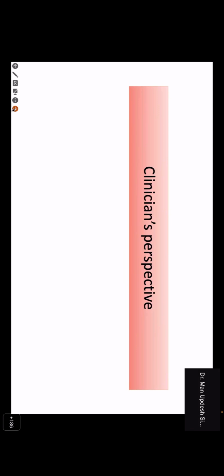in this scenario, I would rather do special stains, even if I don't see too much reaction and changes. A subtle reaction is good enough to do an AFB stain, a PAS stain, and you might be surprised to catch one odd organism without much reaction in immunosuppressed patients. So remember, when the patient has fever and immunosuppression, even without morphological clues which may not be apparent, you go for these stains and you might land up catching. Not very often, but rarely we do see these organisms even without much change in the marrow. These are all disseminated infections.